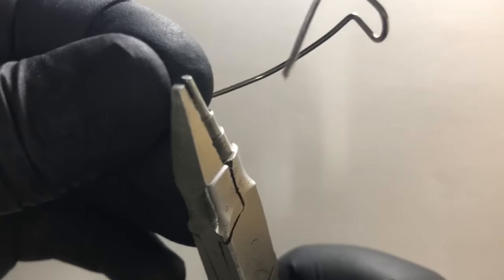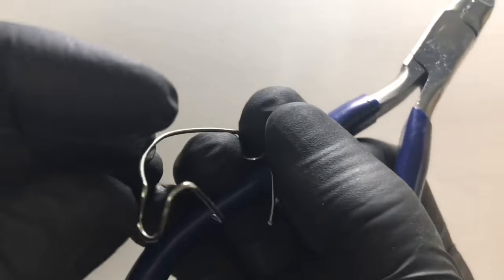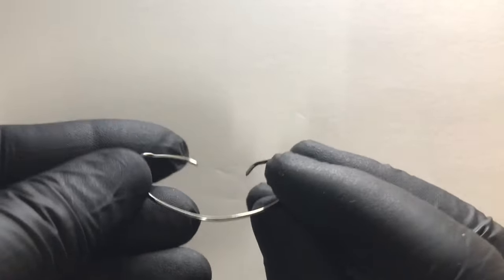We need to give tail end 90-degree bends, as you can see here. Similarly for the opposite retentive arm, we need to give a tail end 90-degree bend. Now let us check for the adaptation.